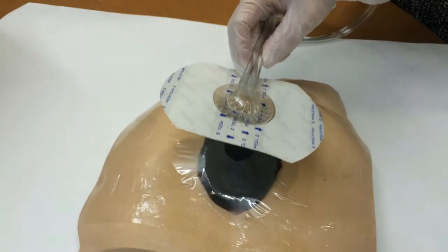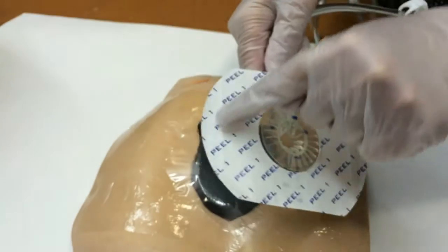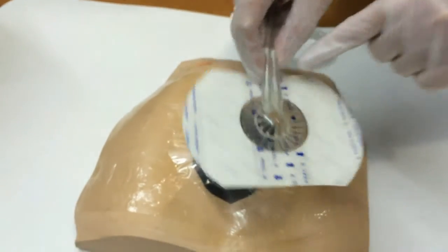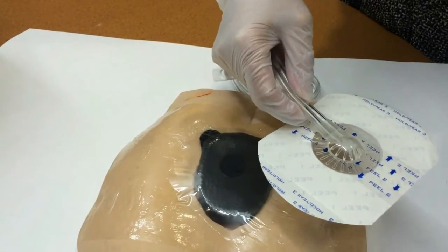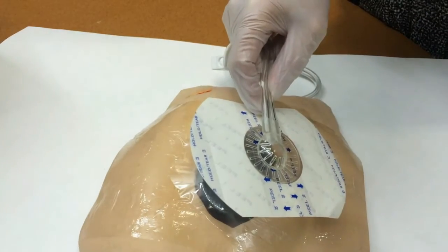Here's our new dome, which is extremely user friendly. It has a peel one side, and then it has peel two, and you can see the arrows are going this way, and then a peel two on this side with the arrows going this way, and then just a number three that's just a hold and tear.